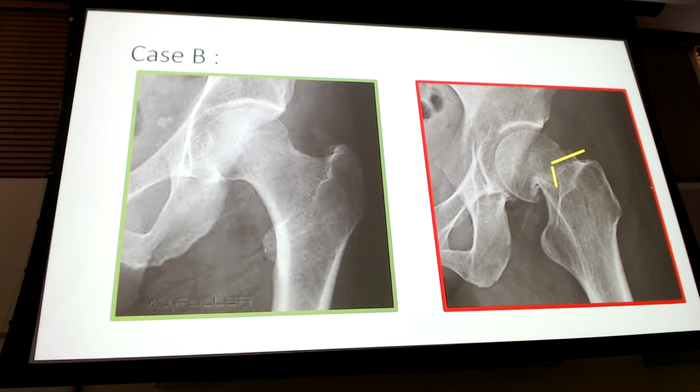If you go back and look at your slides and you look at the avascular necrosis on the femoral head, you'll see how flattened the top part of that femoral head gets. That's really late stage. Okay? So just remember, that's a femoral head issue, not a femoral neck issue. Good question. Does that clear that up? Okay.